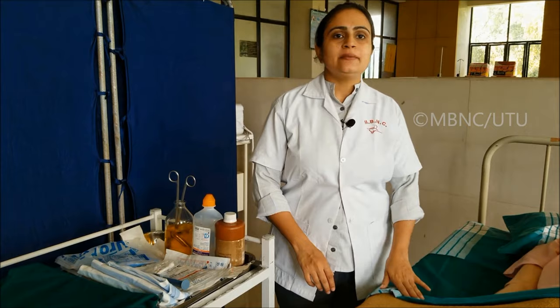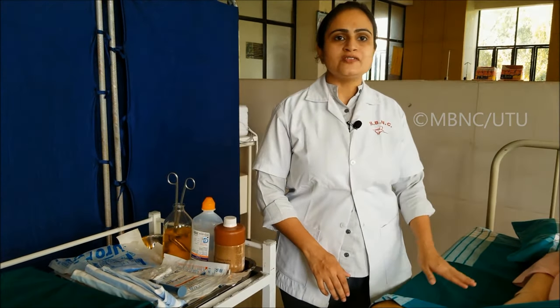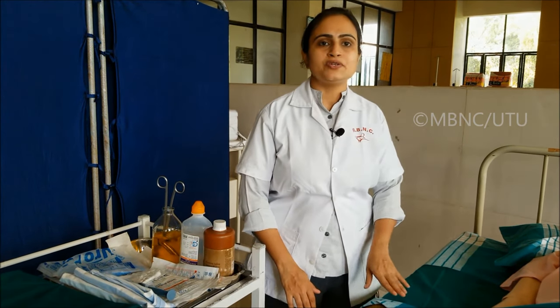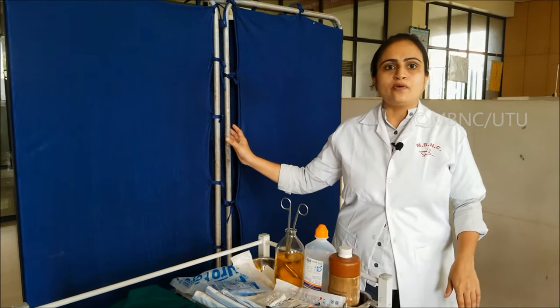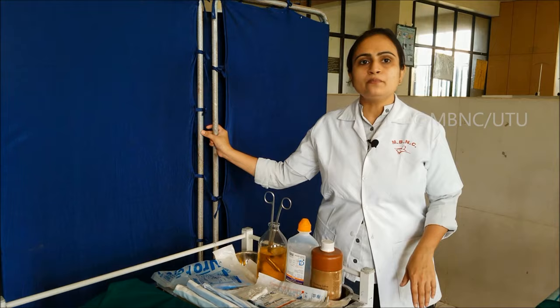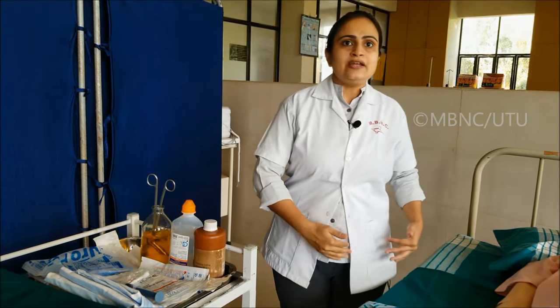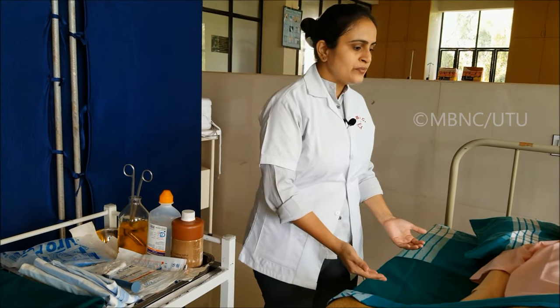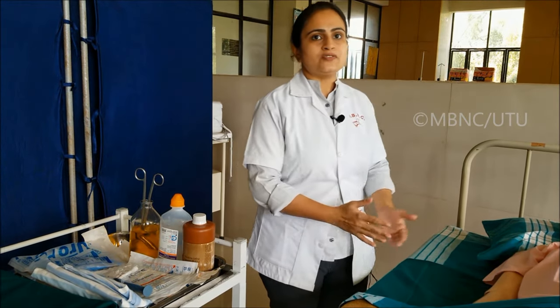For patient preparation, first explain the procedure to the patient to reduce anxiety and promote cooperation. Then provide privacy with the help of a screen to reduce embarrassment. Stand on the right side of the patient and shift the patient closer to you to promote correct body mechanics during the procedure.